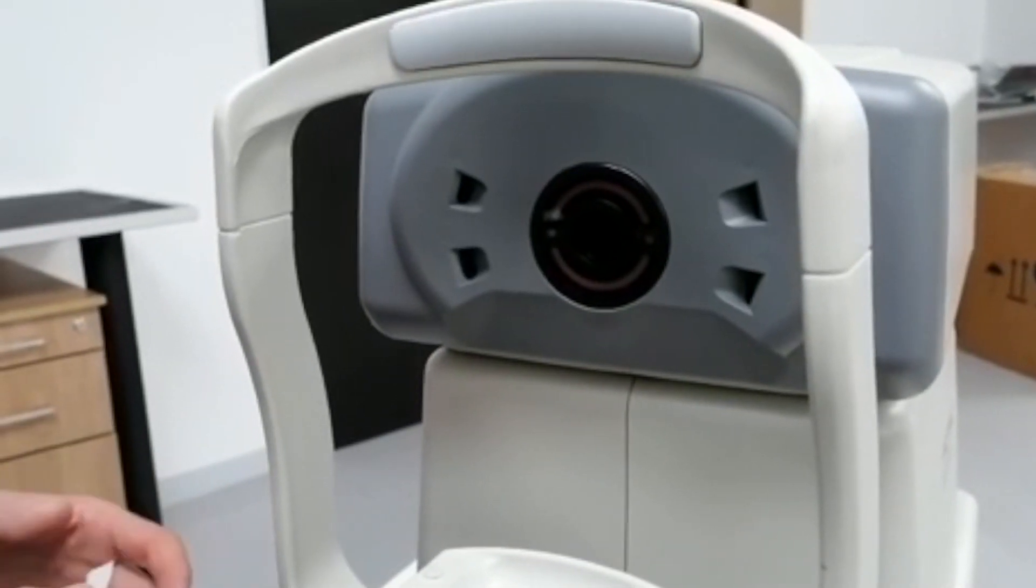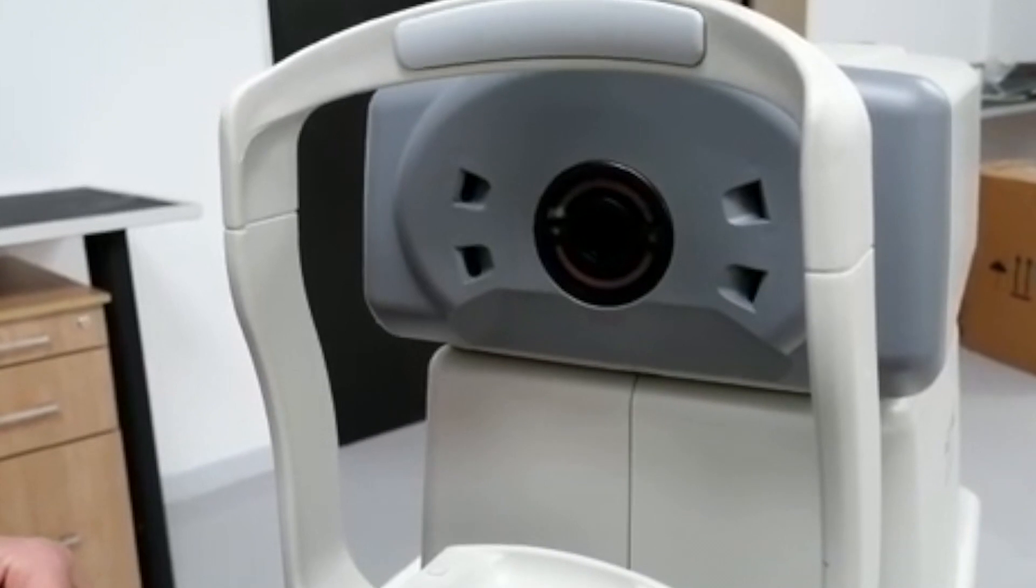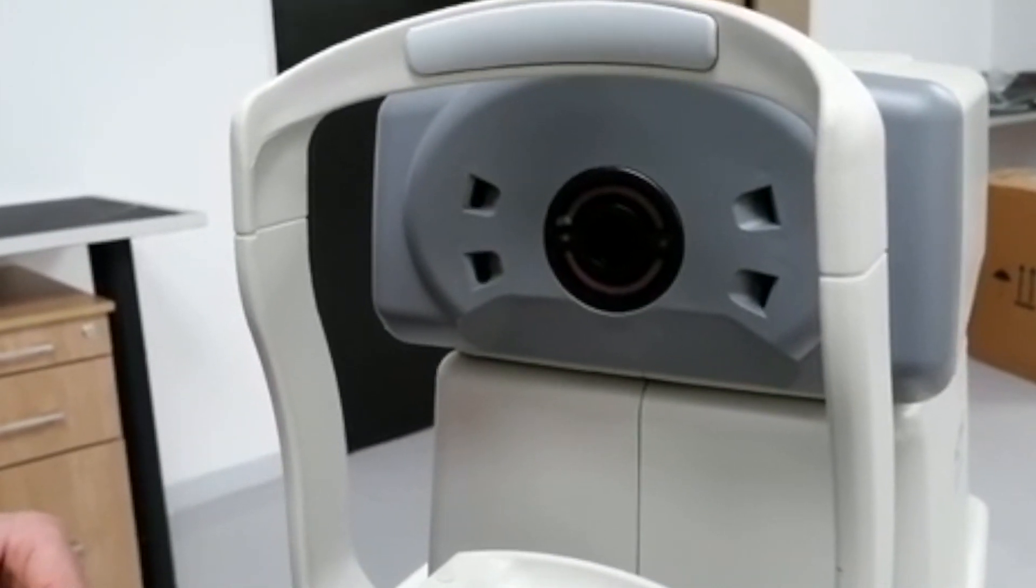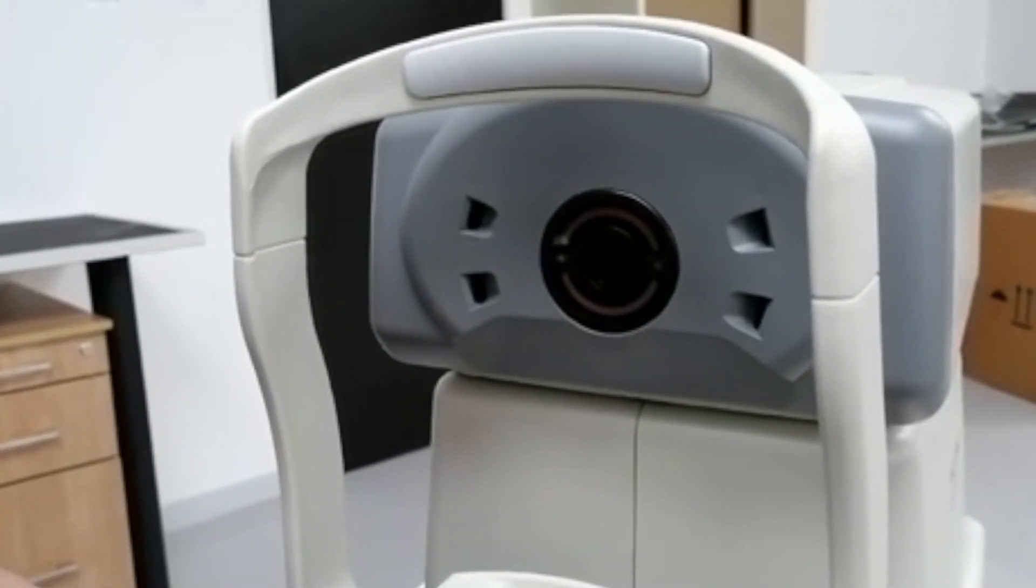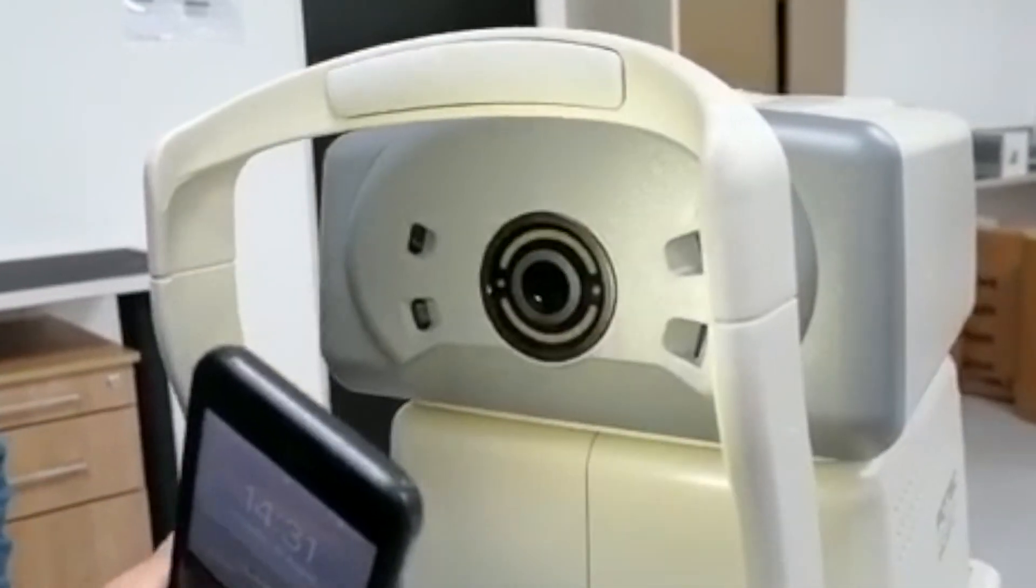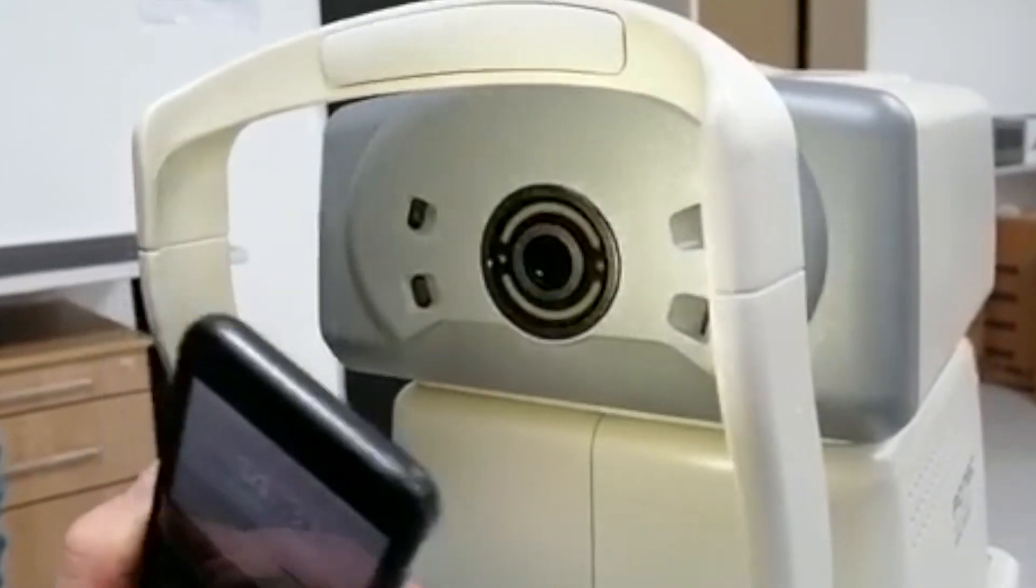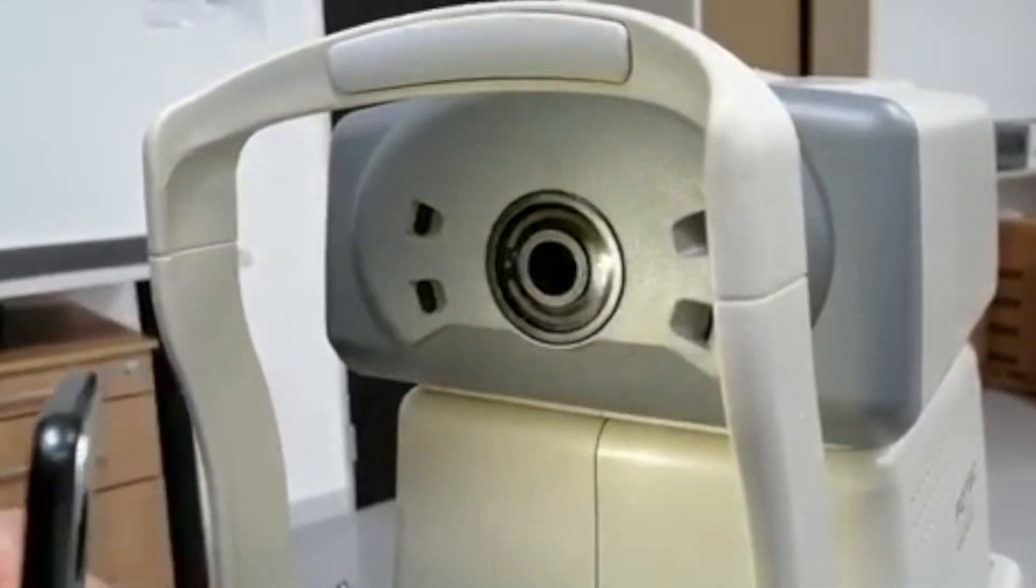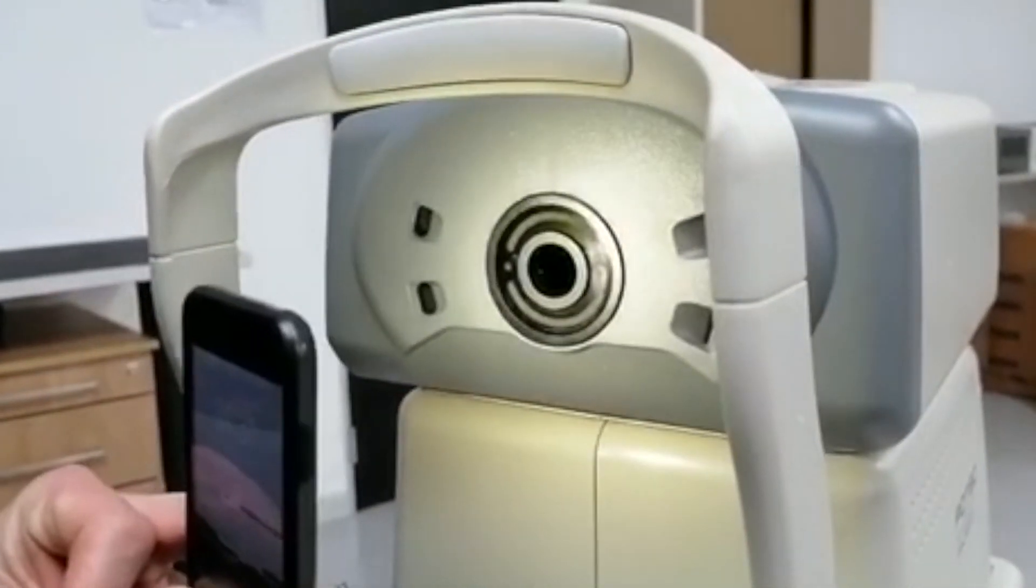Today we're going to do a little video on cleaning the lens on the autorefractor, the PRK 5000. First we look inside if there's any marks or finger marks inside there, maybe makeup or that kind of stuff. Shine a light on the interior lens.